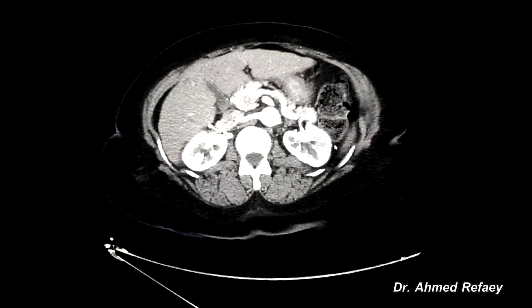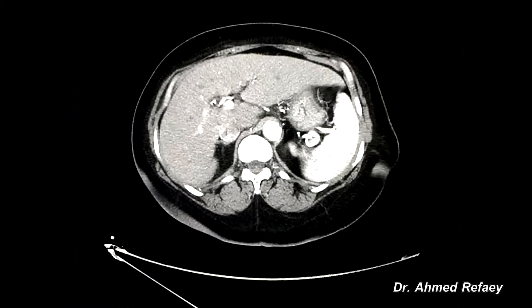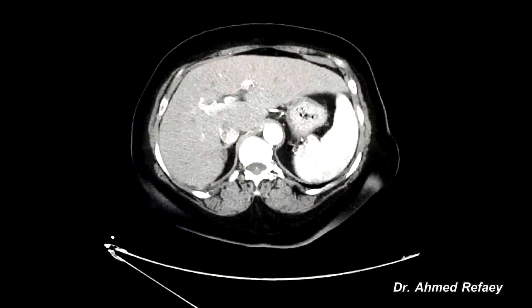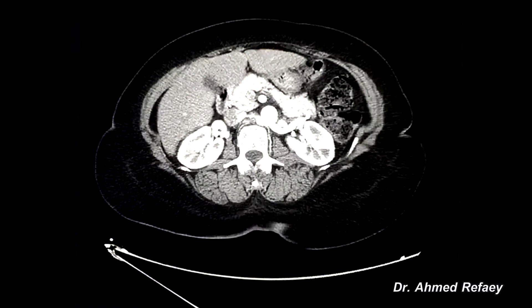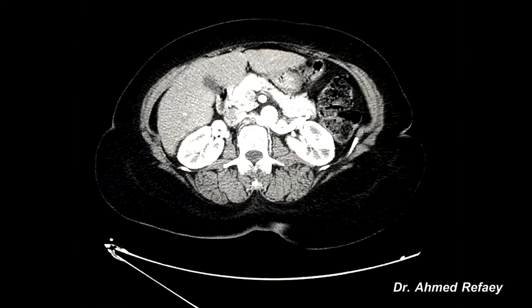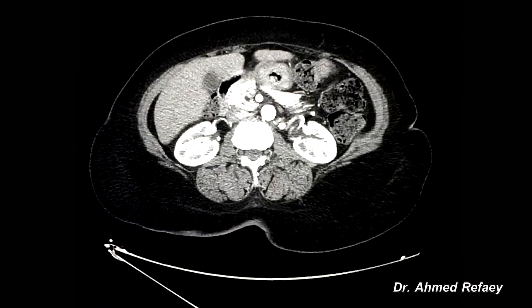In the arterial phase we can also appreciate enhancement of the renal cortex, mottled enhancement of the spleen, and enhancement of the pancreas as you see here.